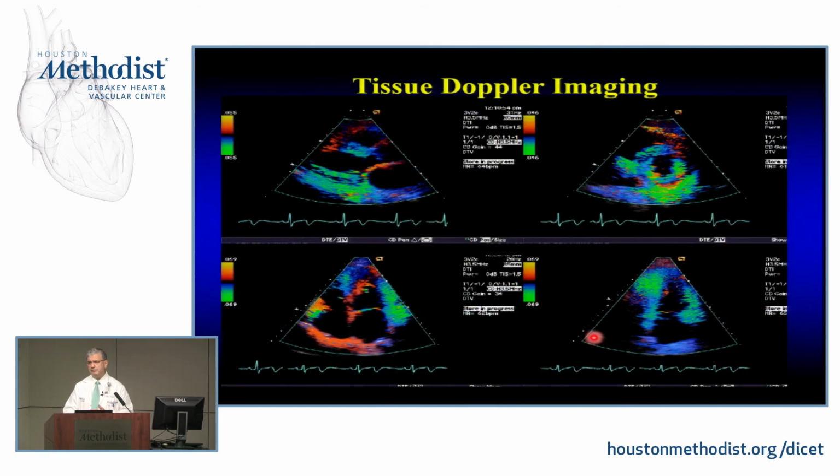Tissue Doppler. With most of these color flow, you haven't seen anything in the tissue because since the inception of color Doppler, we've suppressed it. We did not want to take a look in there. We looked at it 15 years ago. And it's easy to suppress, and the reason is the signal from the muscle is quite different from the signal from the blood.